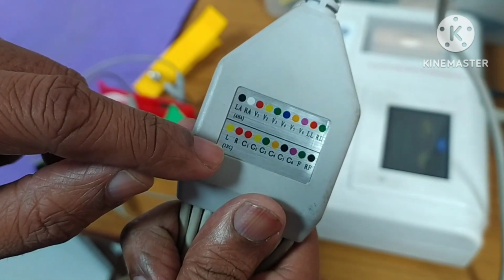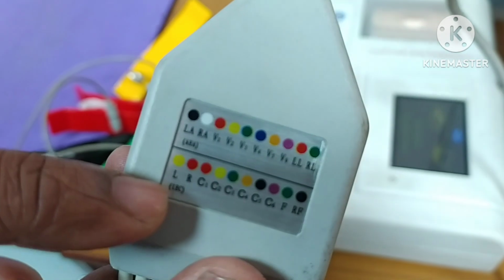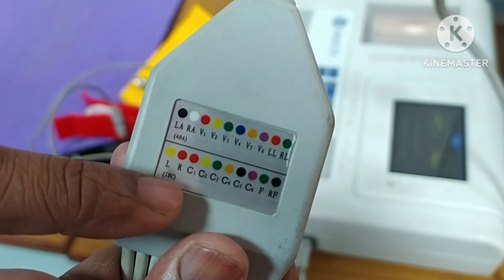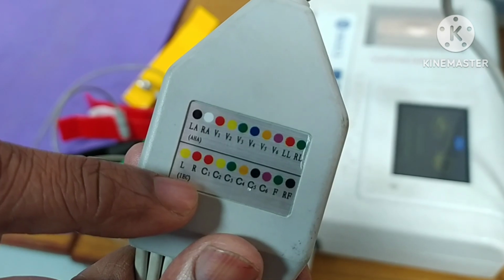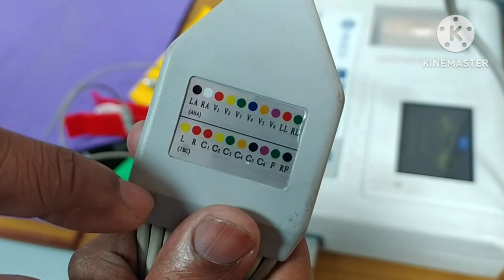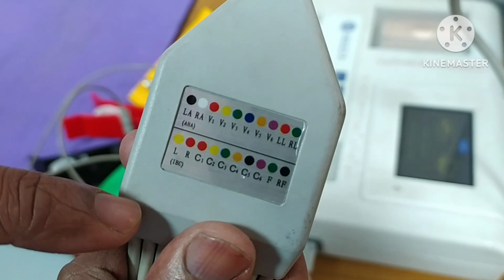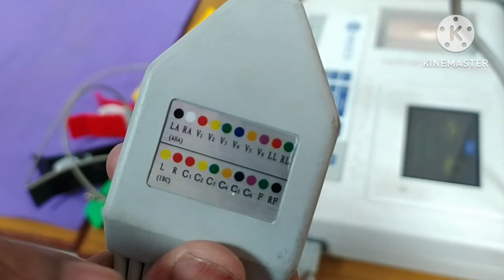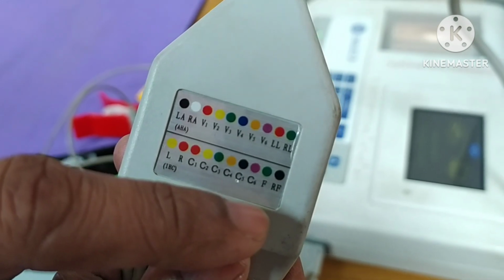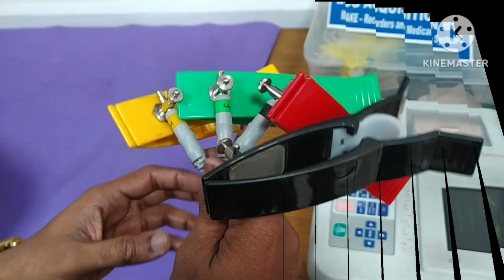L and R are mentioned: we need to put the L electrode on the left arm and the R electrode on the right hand. C1, C2 up to C6 electrodes are used to connect on the chest area, and F is used to connect the left foot, and RF the right foot.